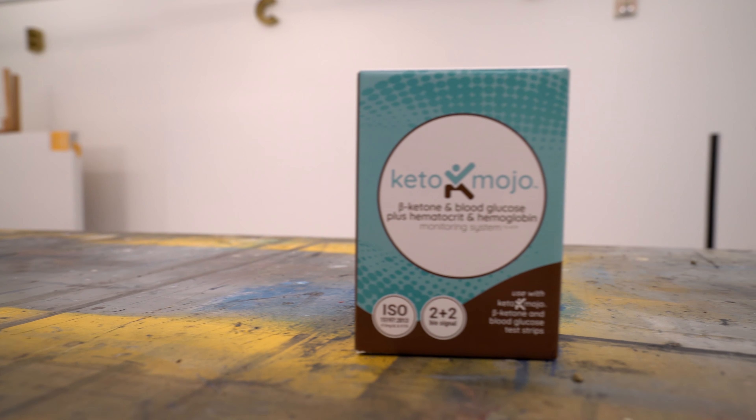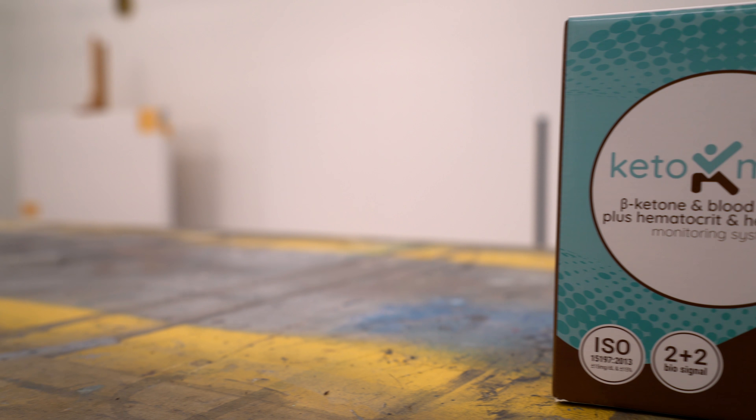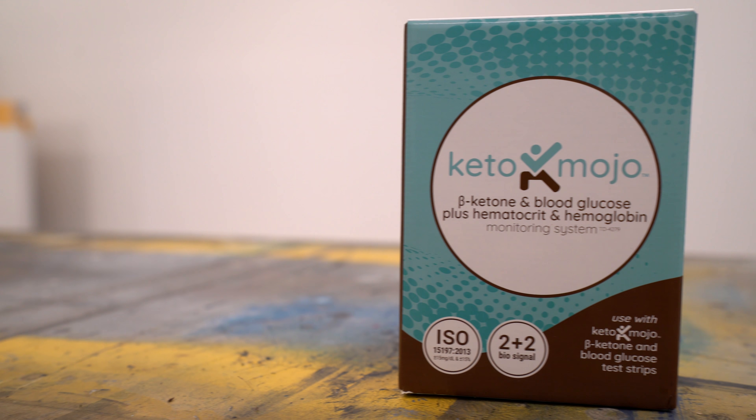What I'm bringing you guys today is an unboxing of the Keto-Mojo. It's a blood and glucose monitoring system, so it uses blood, and you can measure both ketones and your overall blood glucose levels. This is a big advantage for people who are doing a ketogenic diet. If you do have issues with diabetes, you can also use it for that, because you can monitor your overall blood glucose levels with it as well.